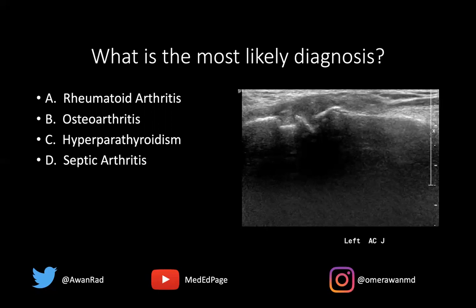If we take a look at the ultrasound, this here is the distal clavicle, and this is the acromion here. Notice that there is more bone formation — this hyperechoic surface is the bone, and this is all posterior acoustic shadowing from the bone. We have more bone than we would expect, so these are likely osteophytes, because this is more bone than we would expect at the acromioclavicular joint. We actually have proliferation of bone in the form of osteophytes, and that's what we're seeing here in the acromioclavicular joint.